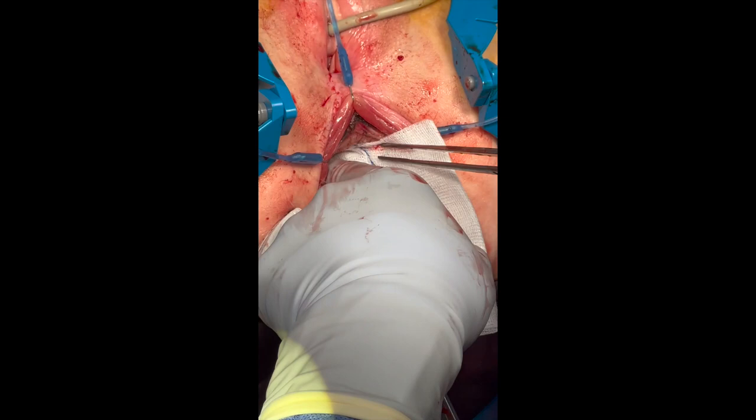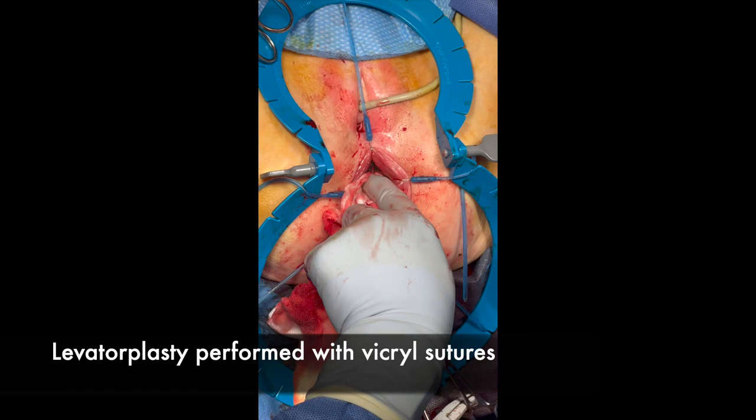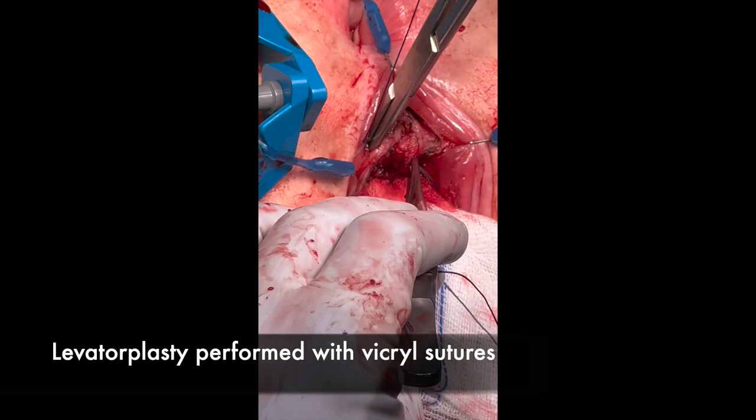Once the prolapse is fully dissected, attention is then turned to the levator muscle and an anterior levatorplasty was performed using a slowly dissolving suture. In this case we have used a zero Vicryl. PDS suture may also be used for the levatorplasty.